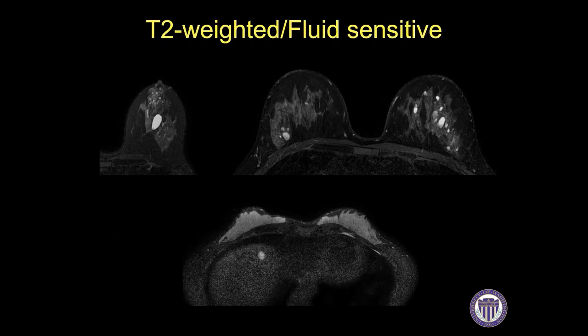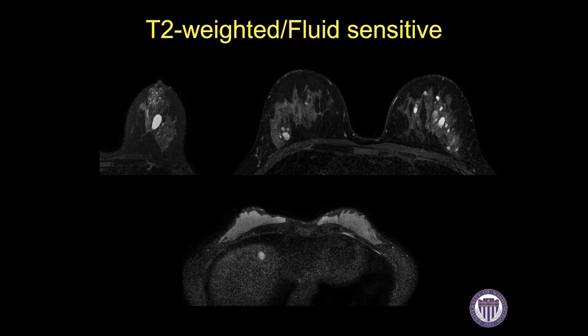Finally, I look at the T2-weighted or fluid-sensitive sequences to evaluate for anything else I might have missed when characterizing distinct lesions. We commonly see cysts in the breast on these sequences. I also find that liver lesions are most visible on T2-weighted sequences, most commonly representing cysts or hemangiomas, although they can be difficult to characterize definitively.